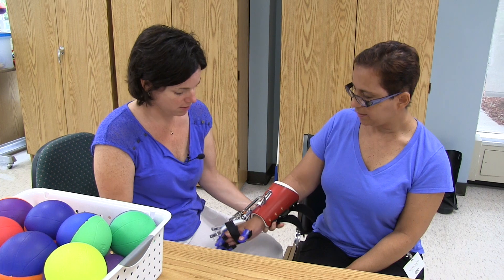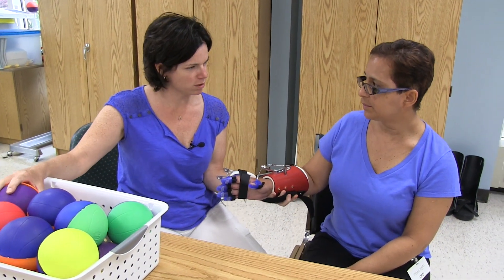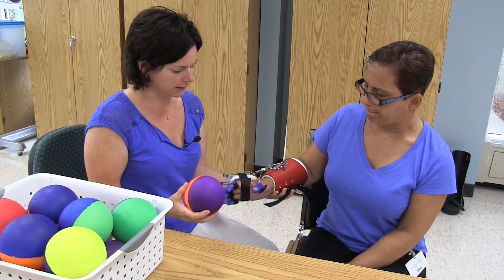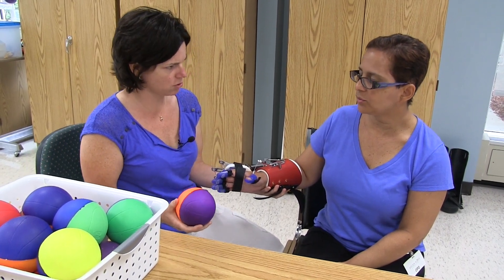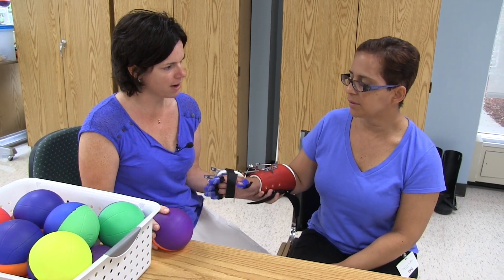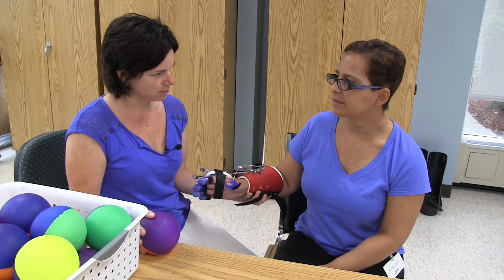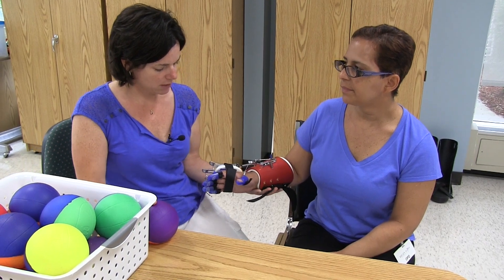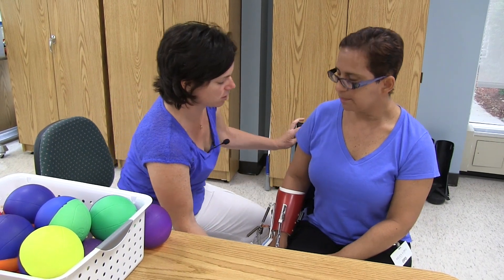We're going to use the Sabo device on Damaris. This is her fourth or fifth treatment. She is post two-year stroke and was here for therapy a year ago. Because of lack of motor control she was unable to use her right dominant arm. Now she has limited forward flexion of the shoulder.